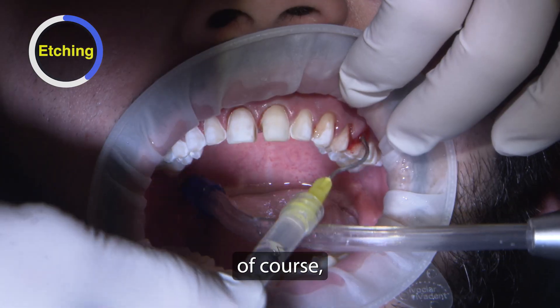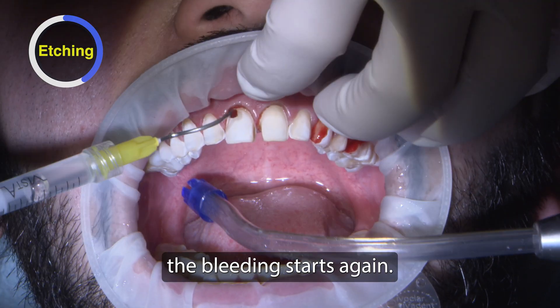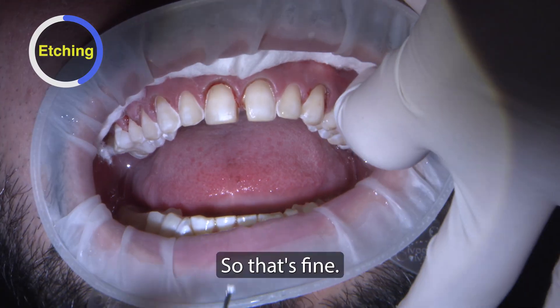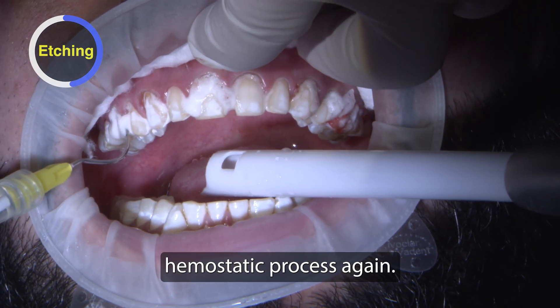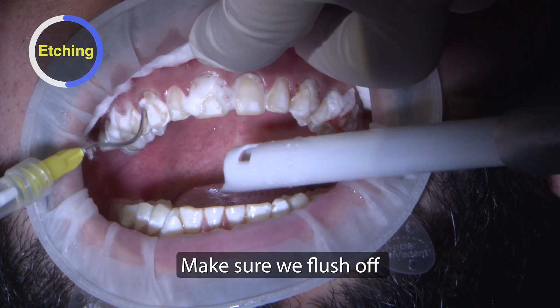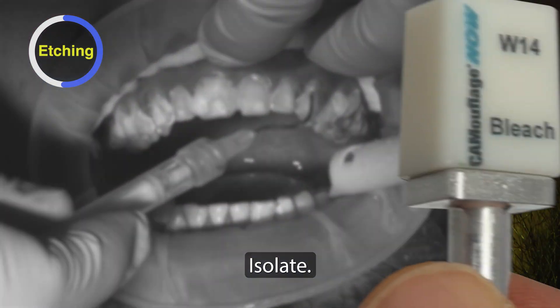After you etch the teeth the bleeding starts again. That's fine — if that happens I just go through a hemostatic process again, make sure we flush off as well as we can, and then isolate.